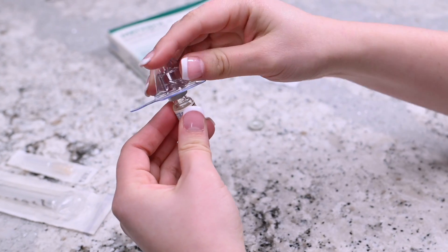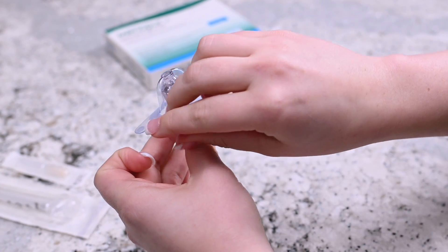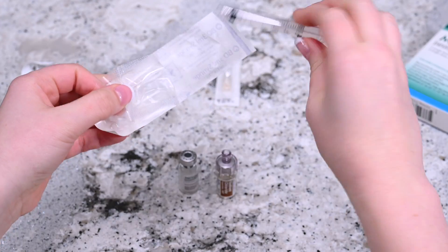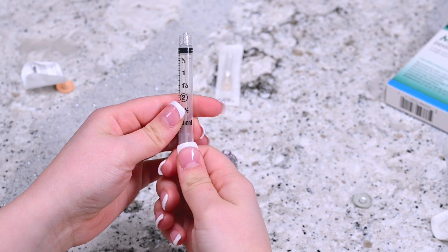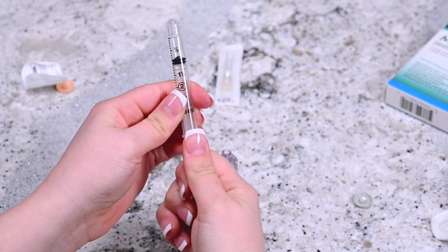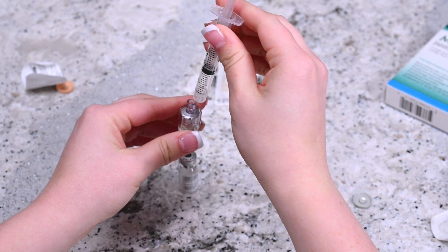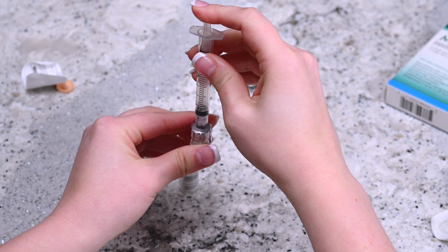Puncture the top of the sterile diluent with the q-cap needle. Remove the remaining plastic packaging. Open the syringe package. Draw air into the syringe by pulling the plunger to 1 ml. Twist the syringe onto the q-cap. Gently apply pressure onto the plunger so that the air transfers from the syringe into the diluent vial.